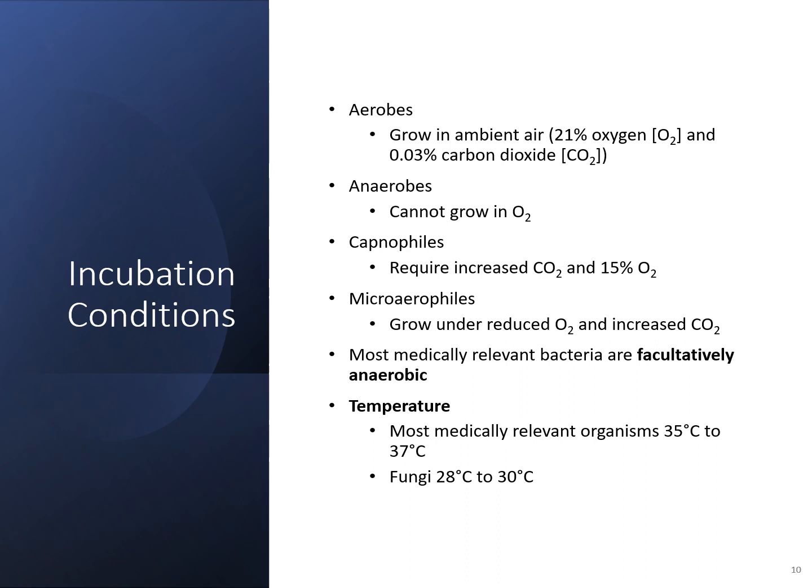Your capnophils require an increased CO2 with about a 15% O2 level. And then your microaerophils will grow under reduced O2 levels but increased CO2 levels. Most of your medically relevant bacteria are facultative anaerobic bacteria, and so they can grow aerobic or anaerobic. Your temperature: most of your relevant organisms will grow between 35 and 37 degrees. And of course, with your fungi, we already covered that those have a lower range as far as where they grow.